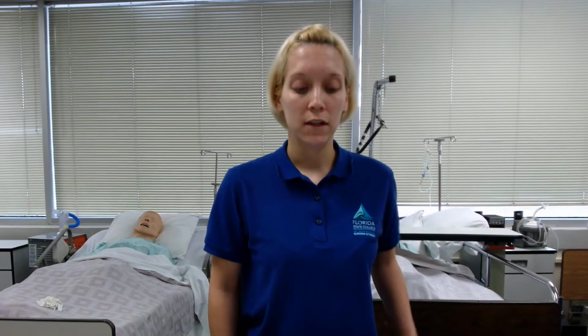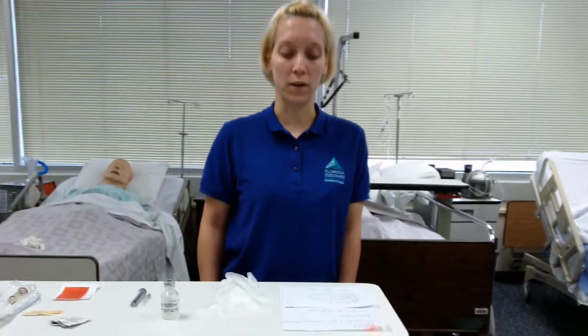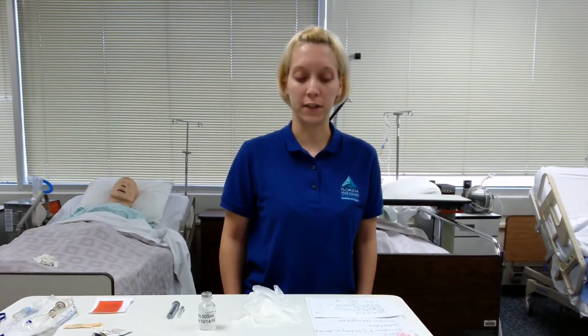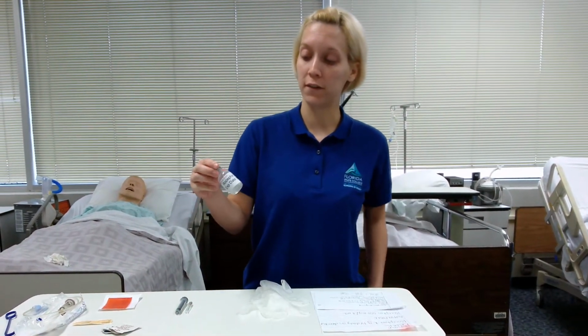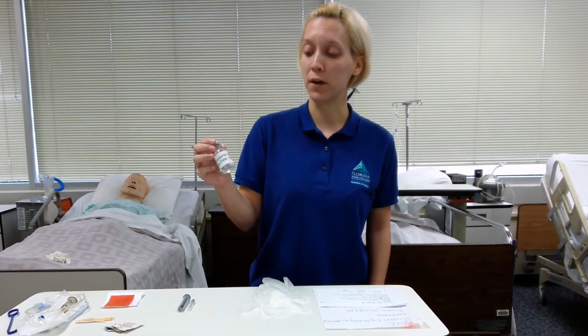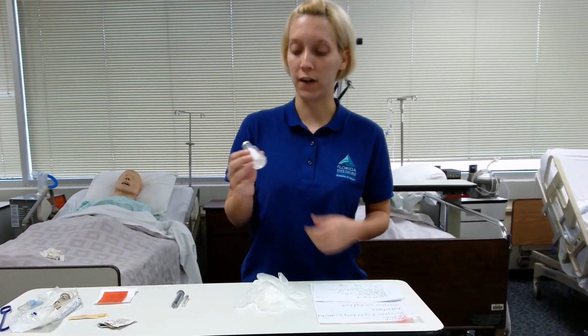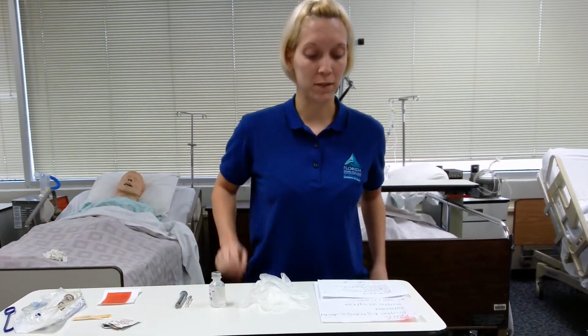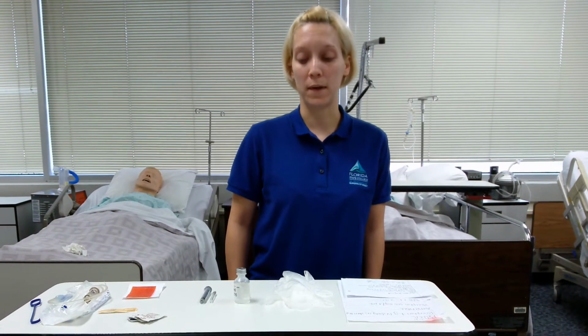Okay, so the first thing I'm going to be doing is checking my physician order in the EMR. For Mrs. Betty Jones, the doctor has ordered Rocephin 1 gram IV due to her white blood cell count being elevated. We have available Rocephin 500 milligrams per mL. So I'm going to check the integrity of the vial and everything. It's 1,000 divided by 500 times 1, so that would give me 2 mLs.